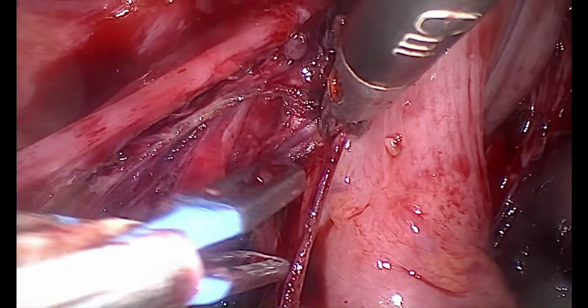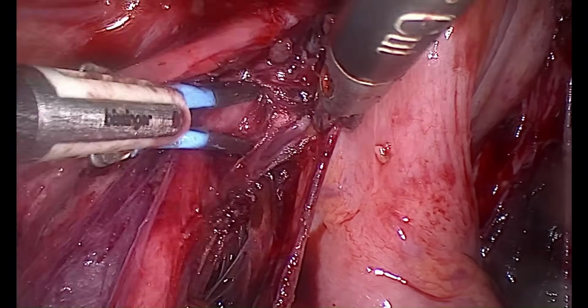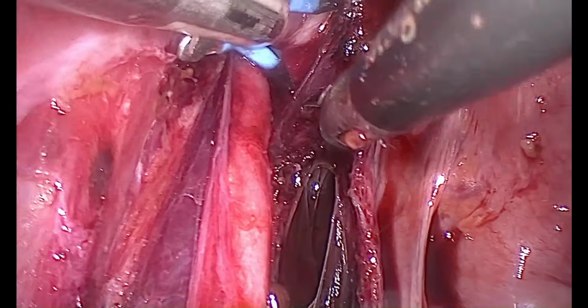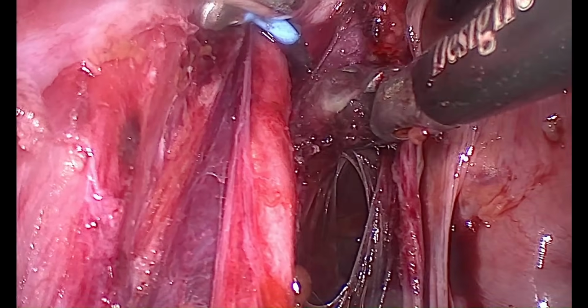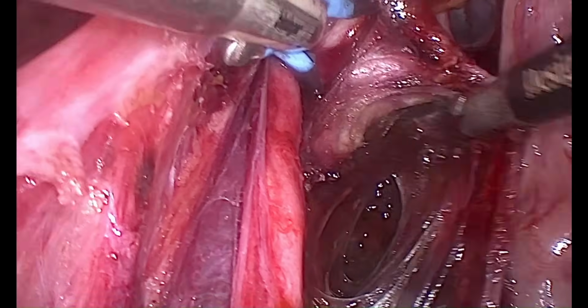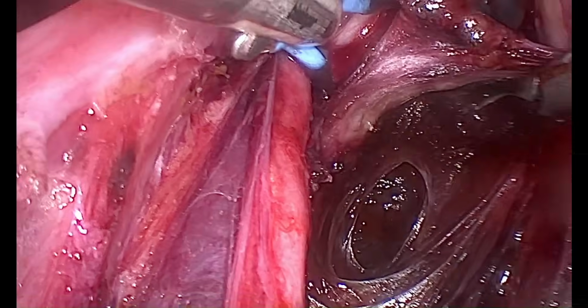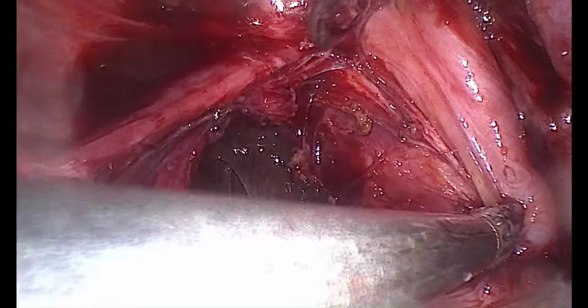Now you can see my other arm is going into the tunnel and safeguarding the ureter, and the other dissector is going to do a dissection in the pararectal spaces, and this is an avascular space. You can see all the rectum is going to get adherent. There is always what is called a pivot joint.